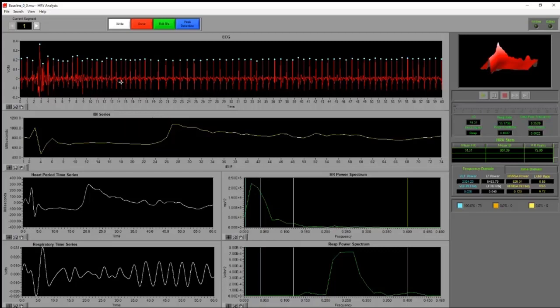So for instance, what we really want out of this is not, in most terms, the amplitude. That's not of concern to us in this case. We're not clinically diagnosing any sort of condition or treating some illness. We're simply looking for the timing between the beats. We want to see the vagus nerve effects on the heart. We want to see how it's modifying the heart rate, and we want to look at the frequency between those.